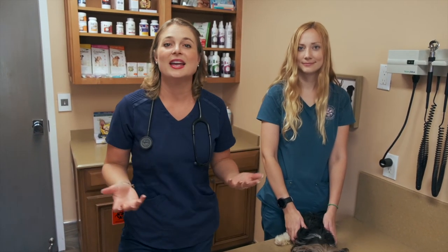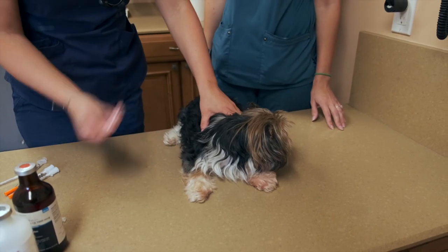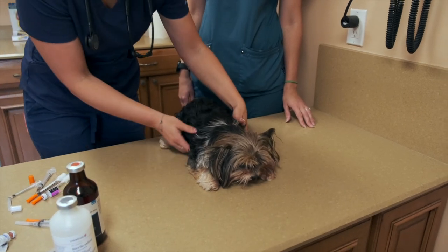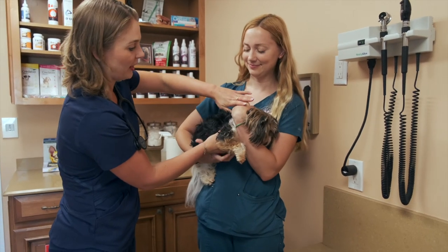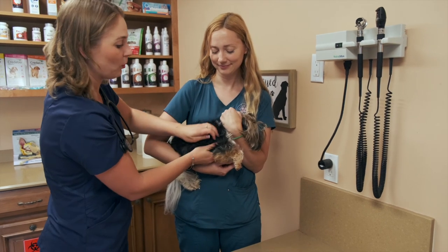I'm going to show you one more way to give a sub-q injection with someone holding the dog — in case your dog is super wiggly and won't let you do this alone. My technician Kristin is here to help hold this cute Yorkie named Mimi, who hates injections. Let's pretend Kristin is a friend who knows nothing about dogs. I'm going to pick up Mimi and tell your friend to hold her with one hand around her neck — not choking her, just restraining her — while you give the shot.